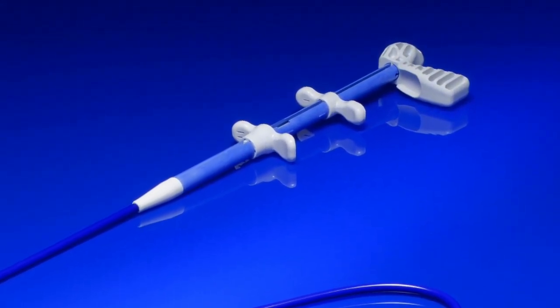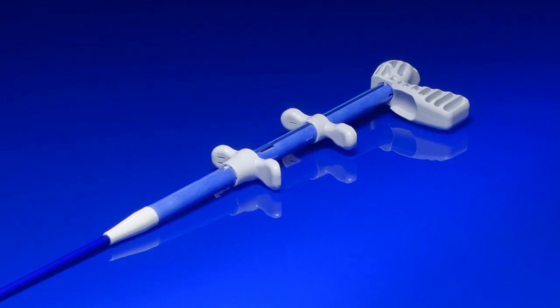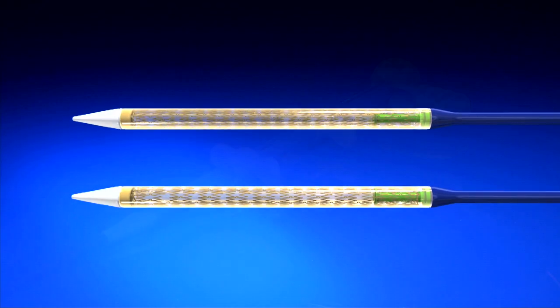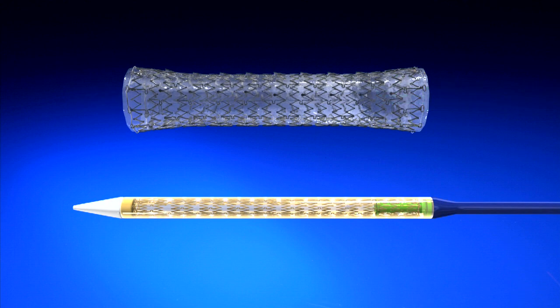The Endomax features a one-handed delivery system that facilitates accurate stent placement. Its preloaded self-expanding stent is laser-cut from a single nitinol tube. The unique laser-cut design results in virtually no foreshortening or elongation commonly found with woven stents.